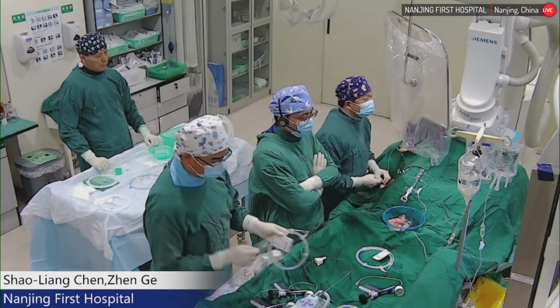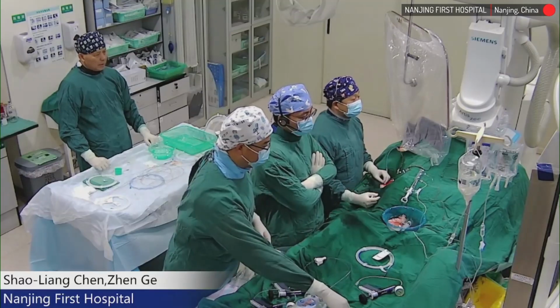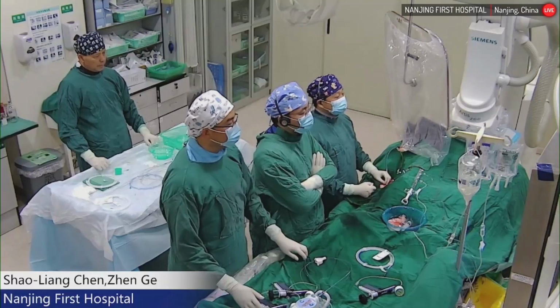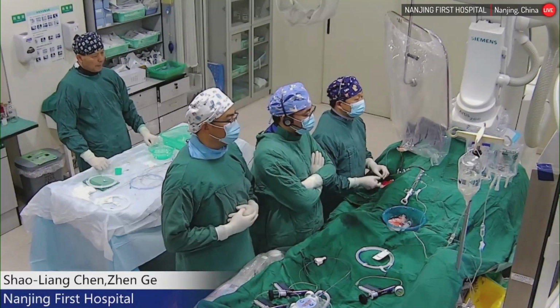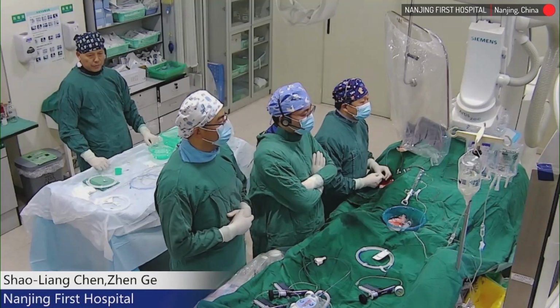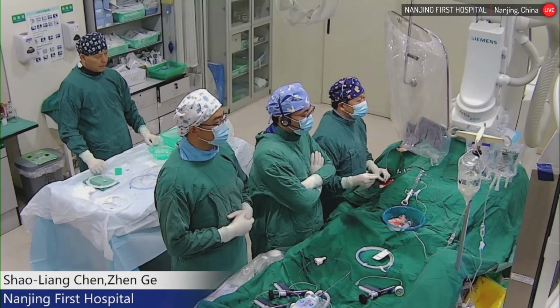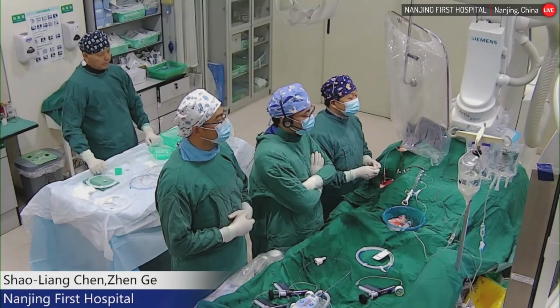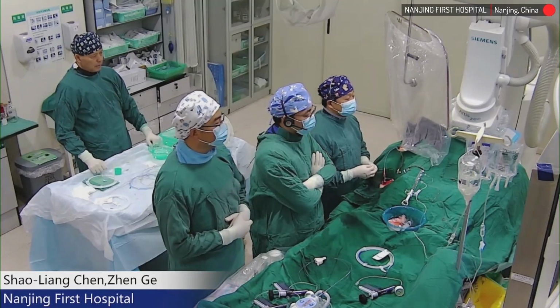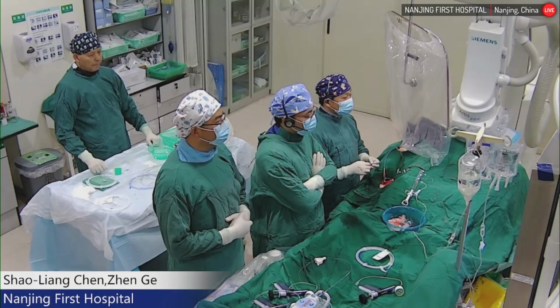Today is the last day for transferring live case to mainstream 360. So I think today is also the conclusive day to finalize the transmission for pilot session. Today we will have two cases, coronary cases with very complex lesion. So now is the first case from Nanjing First Hospital. Dr. Ge and his colleague are ready. So go ahead to introduce the history of the patient.